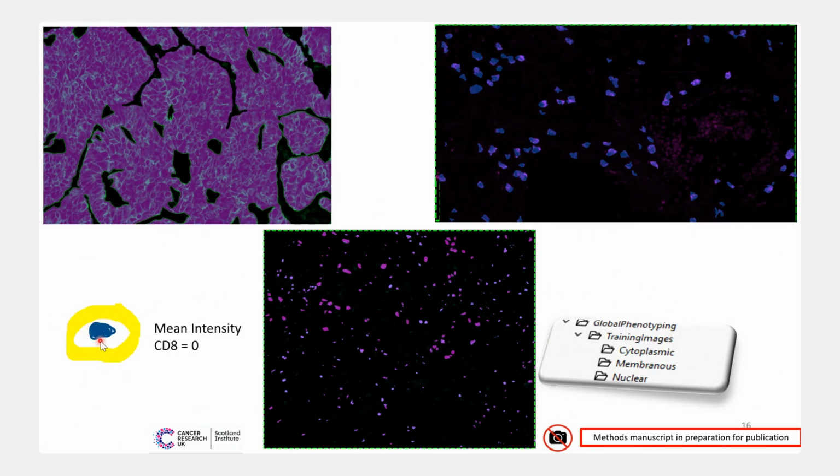So the reason that we gave the entire region of positivity as being positive is so that even if we ran a nuclear segmentation, because it's sitting in the middle and that's been classed as positive, our algorithm is going to say, okay, this cell or this label belongs to a positive, or is positive for CD8, for example.